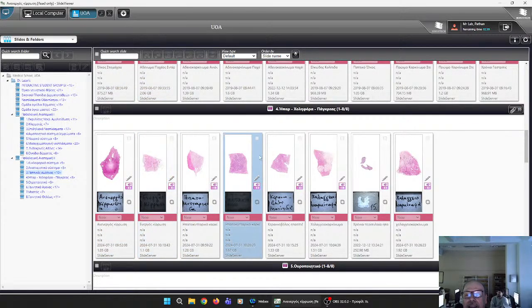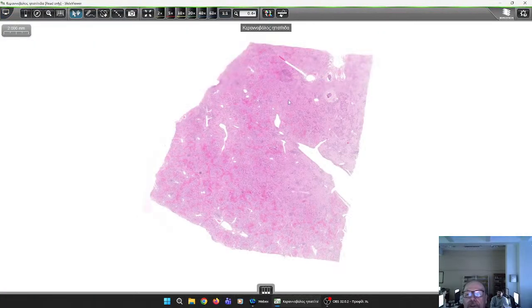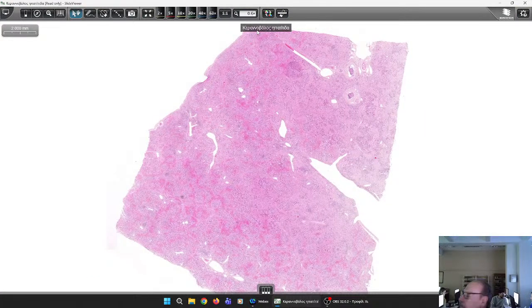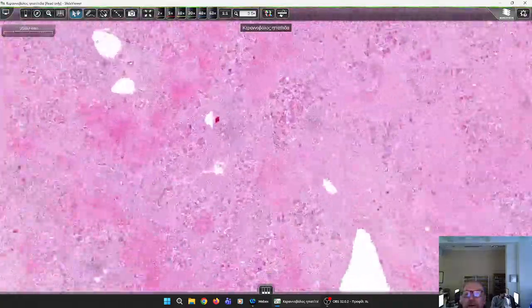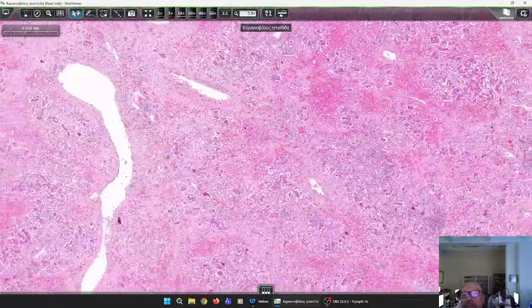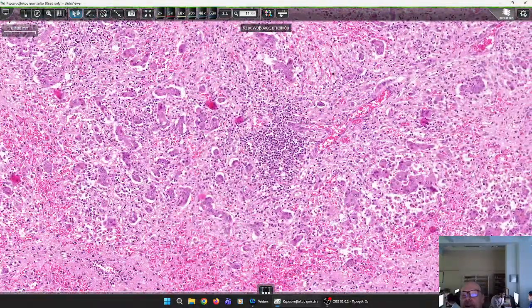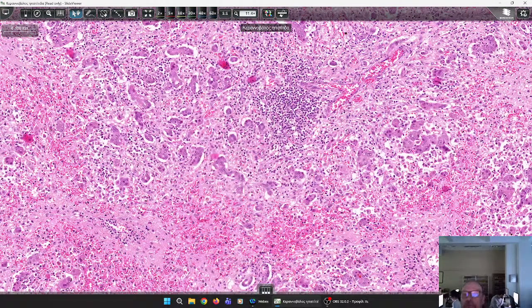Now, here is a sort of great damage in the liver. This is hyperacute destruction of a large part of the liver. So you see how greatly everything is destroyed here. And you see the inflammatory cells. What remains are the remnants of hepatocytes, little islands of hepatocytes. However, we have lymphocytes predominating because this is related perhaps to an immune type of inflammation.